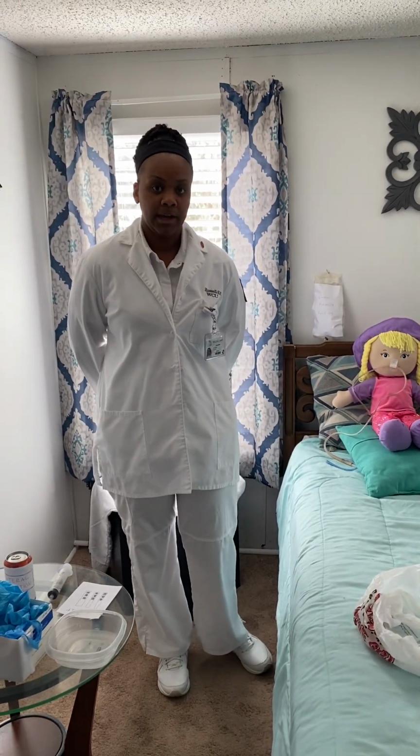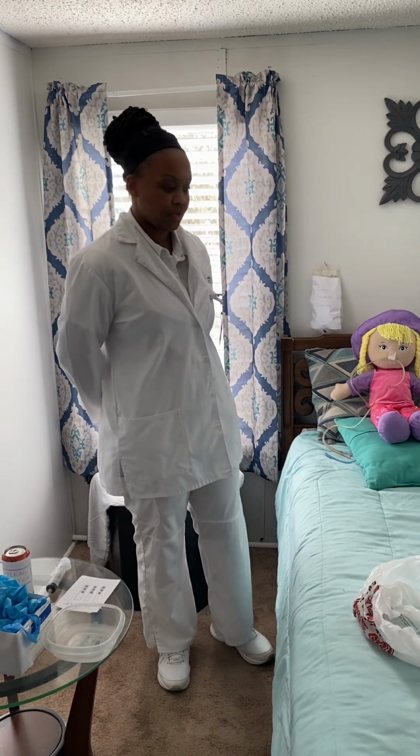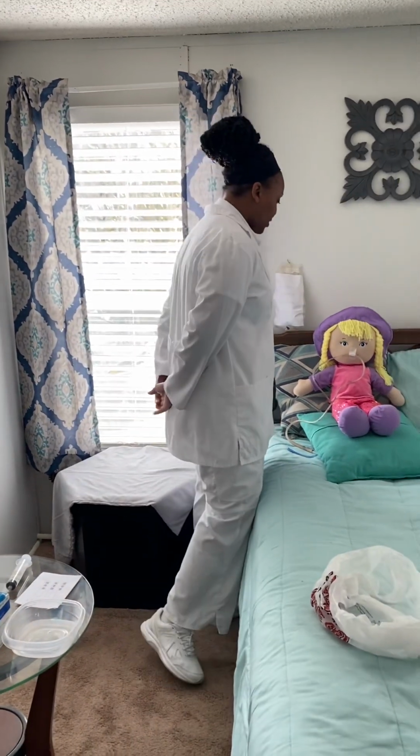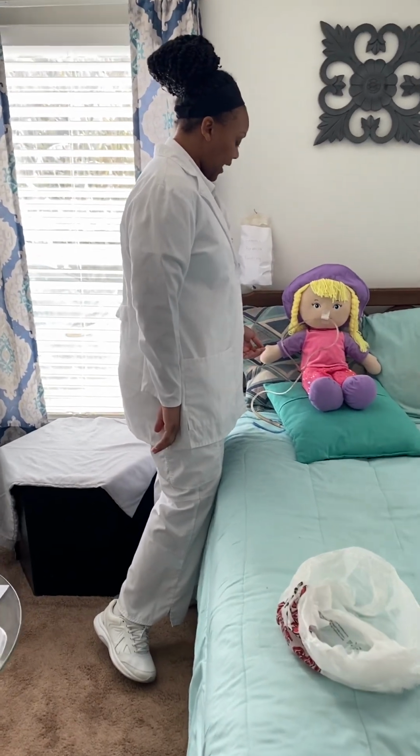Okay, so I'm going to be preparing an enteral feeding for a patient. So the first thing that I would do is verify my doctor's orders. I would identify the patient, so I'd have the patient state their name and date of birth for me. I would ask the patient if they have any allergies.